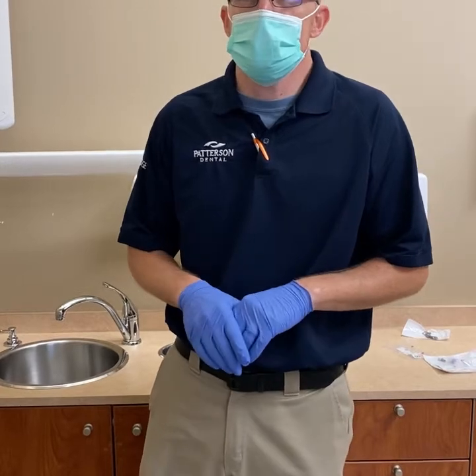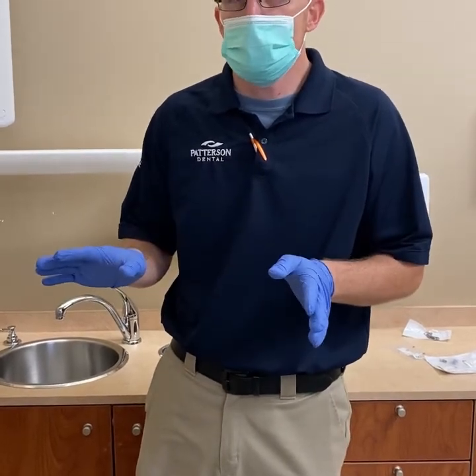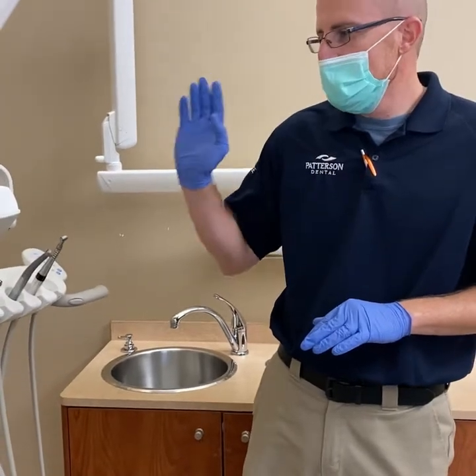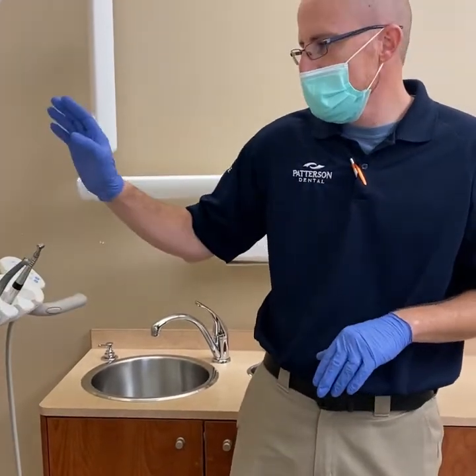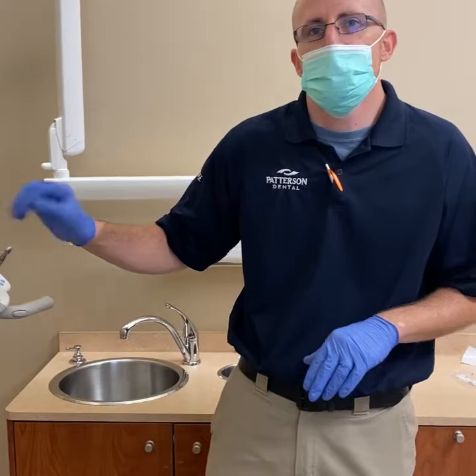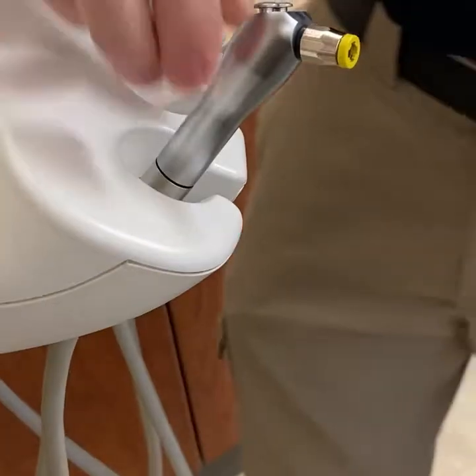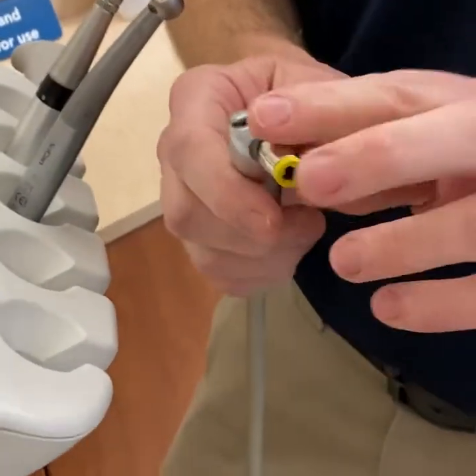Hi, this is Chris. Today I'm going to show you a few quick and simple fixes that you can do in your office to help you out, maybe save some service calls. A couple things with your syringes, and then we'll move to the handpieces.